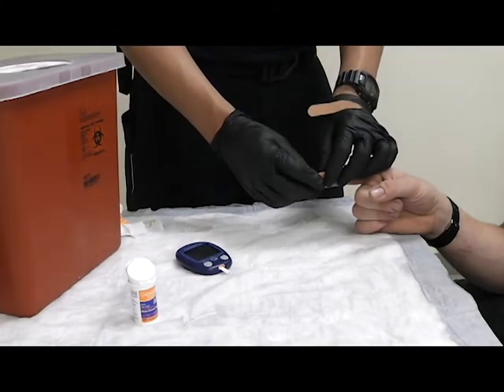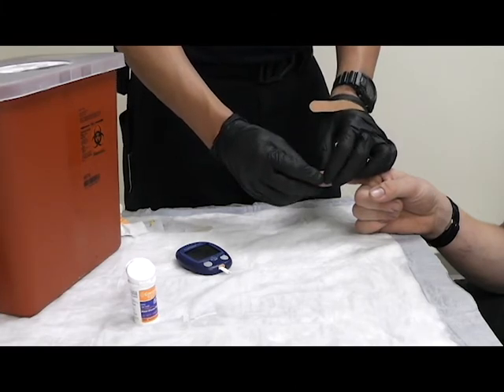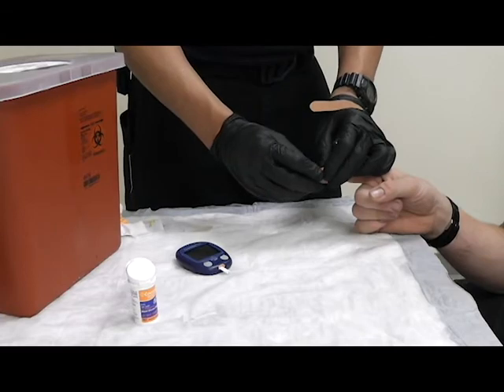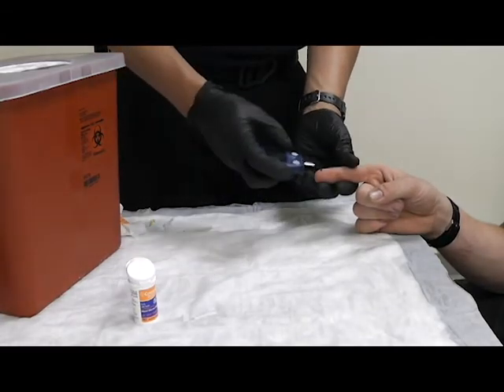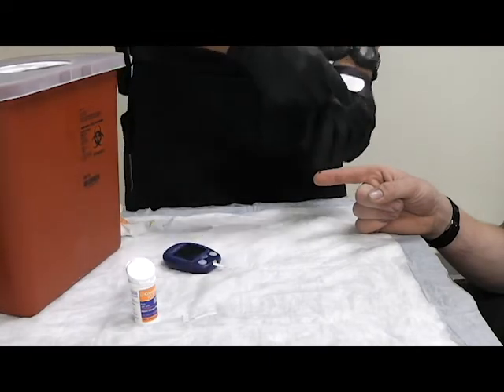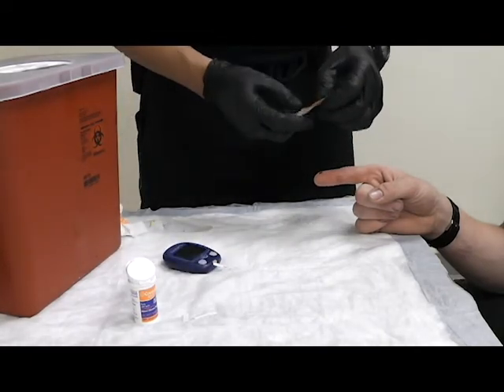Sharps disposed of. Squeeze a little bit to get some blood. Once enough blood has come out, obtain it with the strip, set that to the side, and immediately apply a bandage.